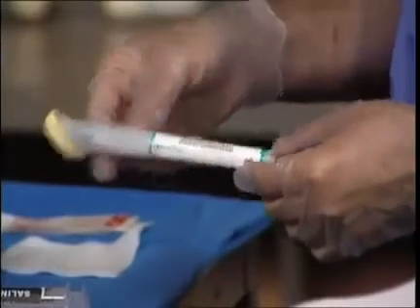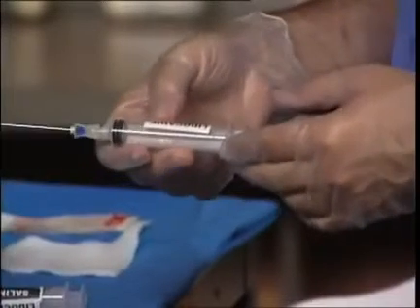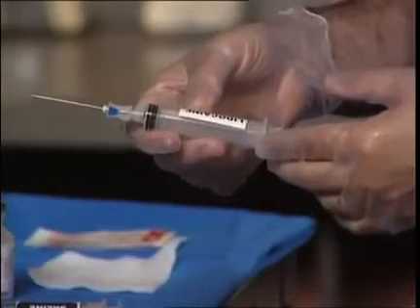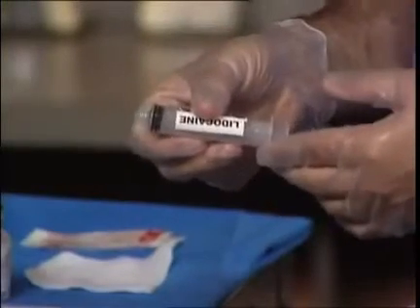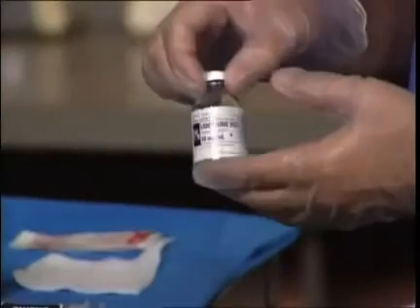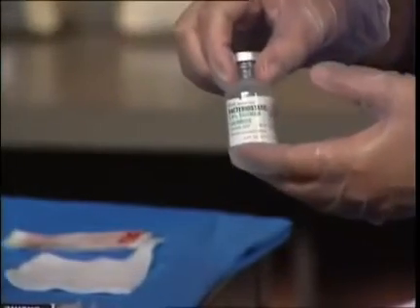In order to facilitate a proper block, the following equipment is required: a chlorhexidine prep for sterile technique, a local anesthetic syringe with a 27 gauge 1.5 inch needle for local anesthetic placement, preferably 1% bicarbonated, buffered lidocaine, a syringe containing the epidural steroid mix, which is composed of 1% 1 cc lidocaine, 6 cc's of bacteriostatic saline, and then 40 to 80 milligrams of triamcinolone Kenalog, which is a particulate steroid.